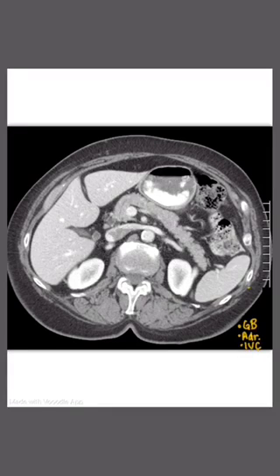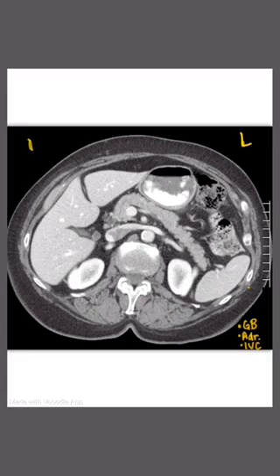So let's just orient ourselves. Over here is going to be the left side of your patient, and over here is going to be the right side of your patient.